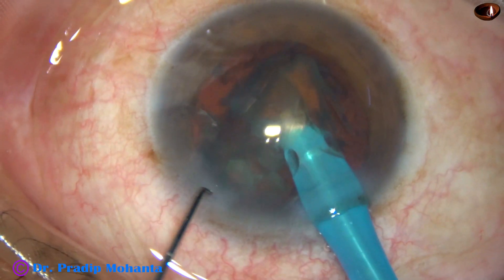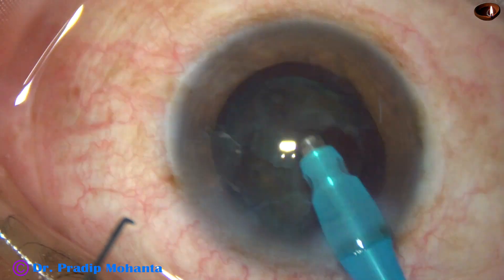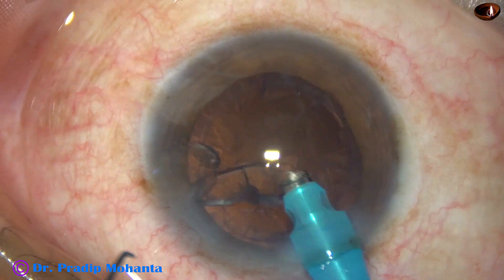And now, with the help of a 26-gauge bent needle cystitome, the anterior capsule is incised and a nice capsular tag is raised.